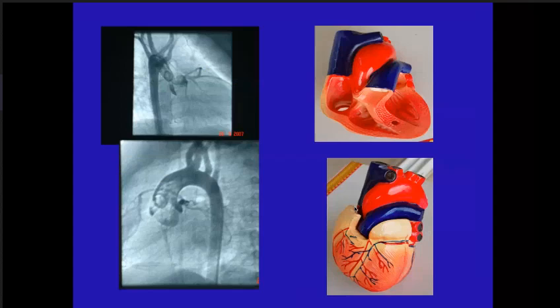Yes, sir. So when you have an anomalous coronary artery, you have to identify where the pulmonary artery is and see whether it's in front or behind. It can go in front of the pulmonary artery, it can go behind the pulmonary artery, it can go even behind the aorta. There are three or four different courses for anomalous coronary artery. Please read up everything about it. Now, if it is in front of the pulmonary artery, it's important for patients with tetralogy of Fallot. For example, this patient has the right aortic arch and all that, therefore must be tetralogy of Fallot. It's very important it's crossing in front. If it is behind the pulmonary artery, in between the pulmonary artery and aorta, it can cause compression. If it is behind the aorta, it is safe. Nothing can compress it there because behind the aorta is only LA. LA can't compress it.